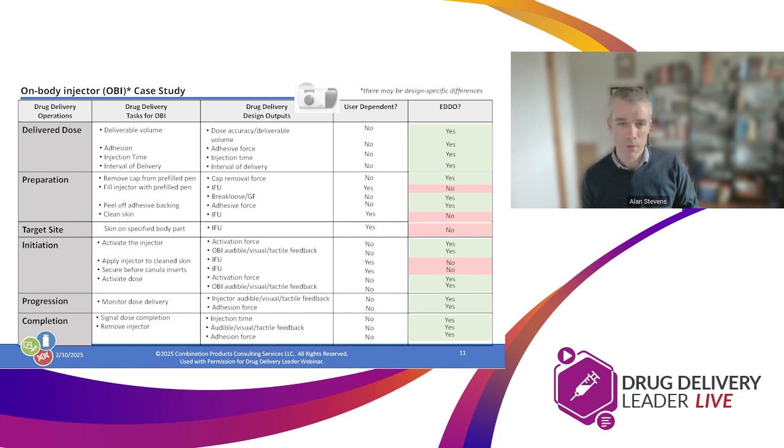Part of the way I've been interpreting what the agency is saying here is that their intent is to focus on device performance and ensuring reliable device performance as it relates to drug delivery.